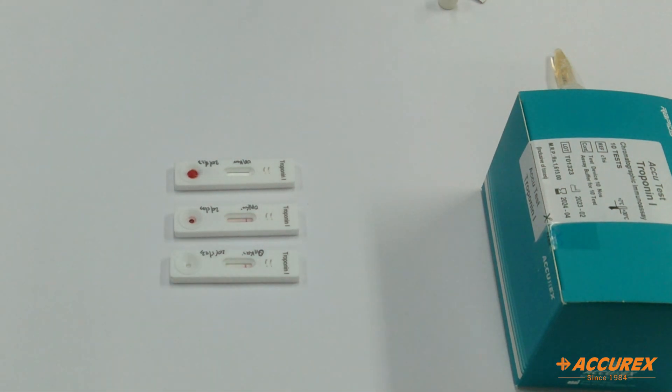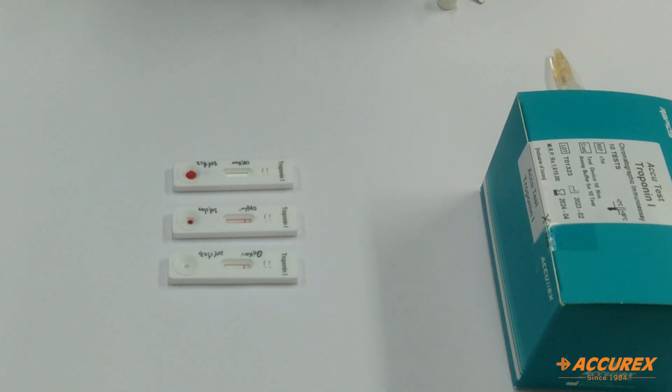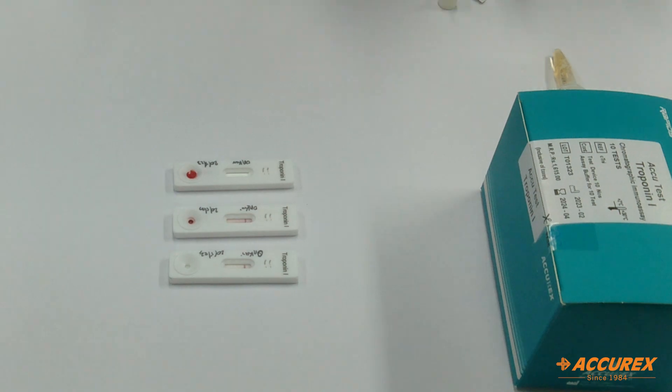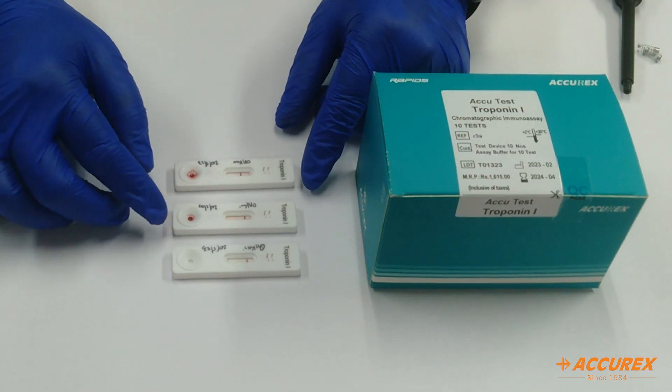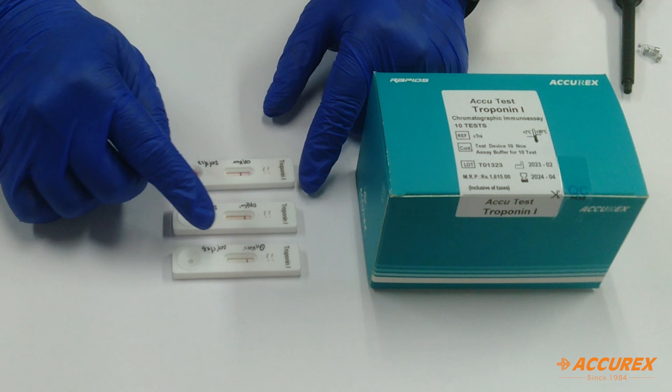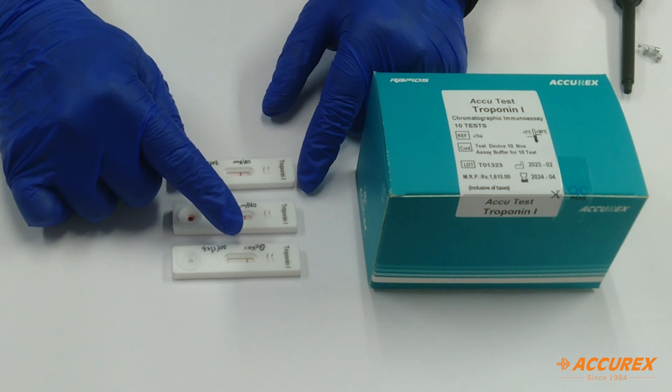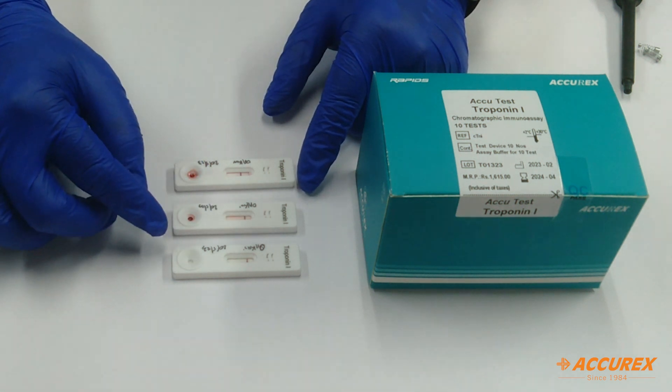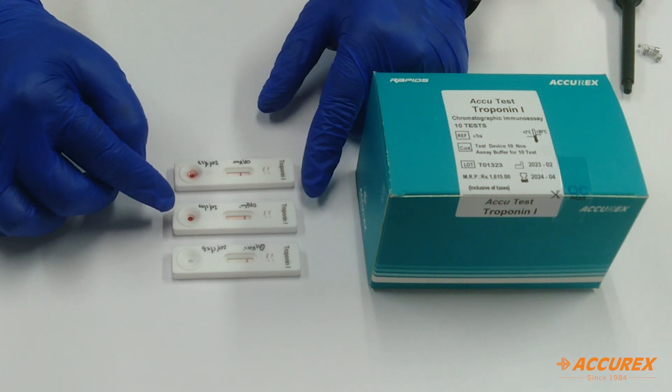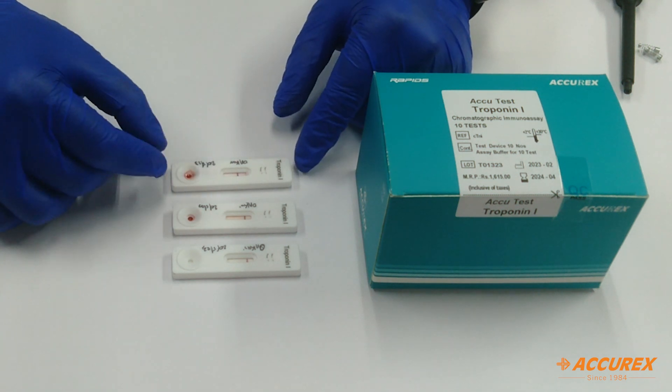We will wait for 10 minutes for the result. The 10 minutes has been completed. You can see one line has appeared near the control line, so it means the test is negative. In whole blood also it has been showing one line, so it means all the tests are negative.